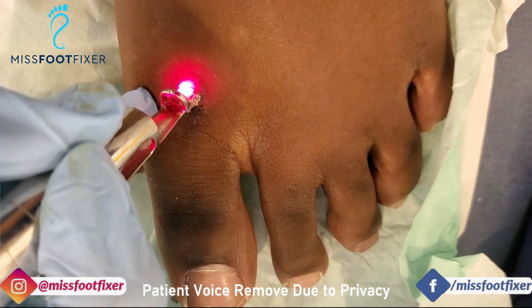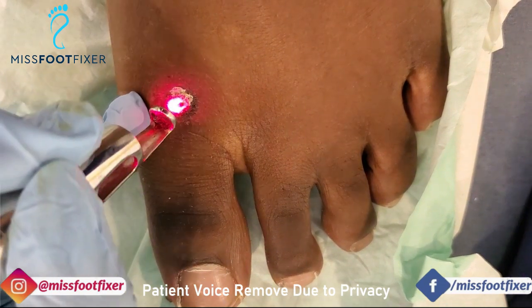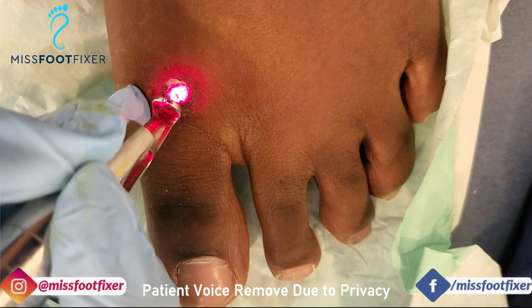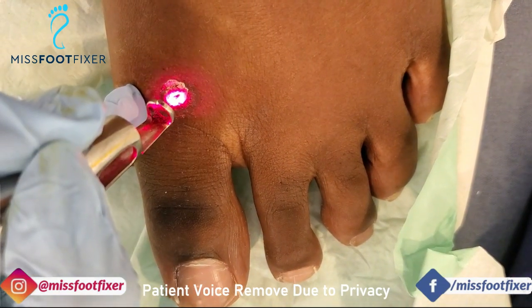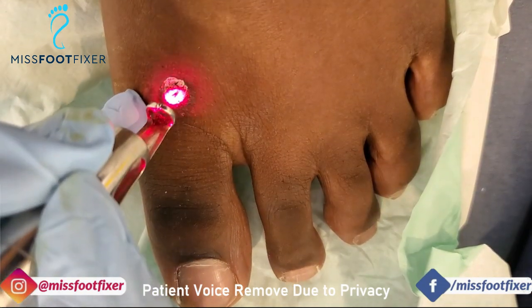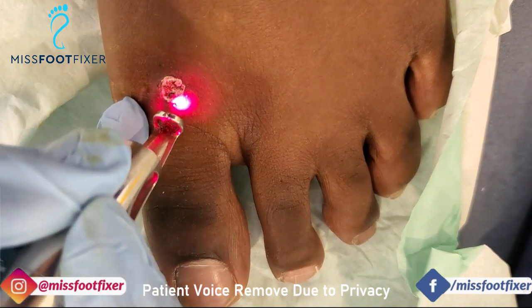So this patient is considered a high-risk patient because he's got immunosuppression. So that's why the wart keeps on coming back. And so that's normal. So it's like barbecue here.